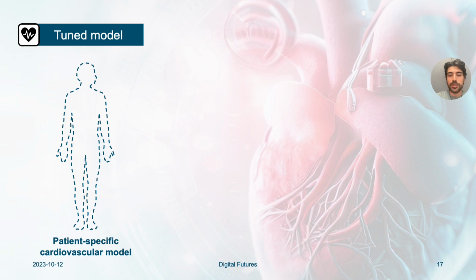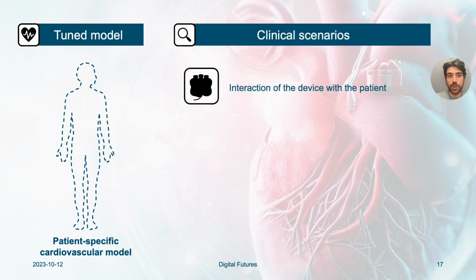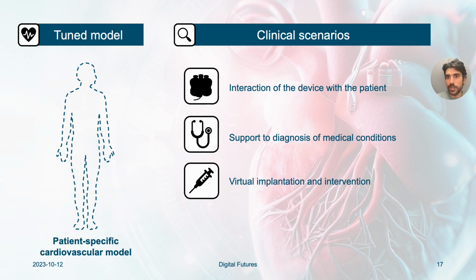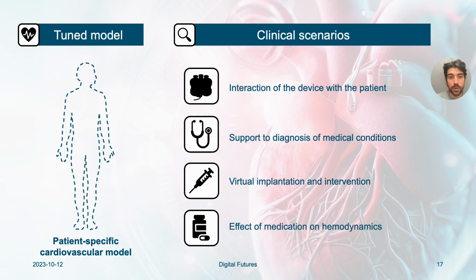The tuned cardiovascular model can then be used to explore different clinical scenarios. It can be used to investigate the interaction between a medical device and the patient, or to support the diagnosis of a medical condition. It can also be used to simulate the implantation of different devices and different kinds of interventions, or to assess the effect of medication on the patient's hemodynamics.